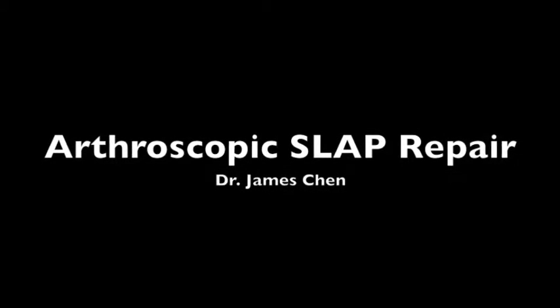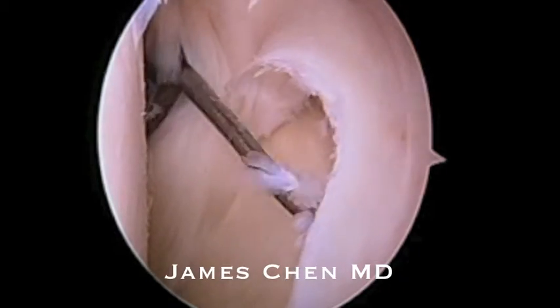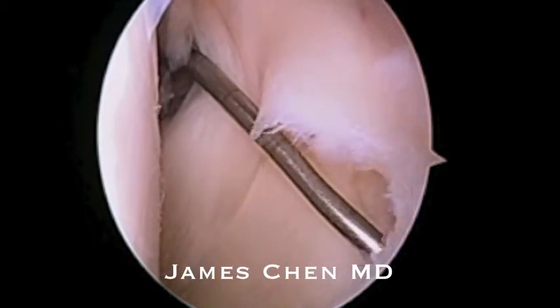This is a video of an arthroscopic SLAP repair. I am probing the superior labrum and seeing the tear from anterior to posterior.